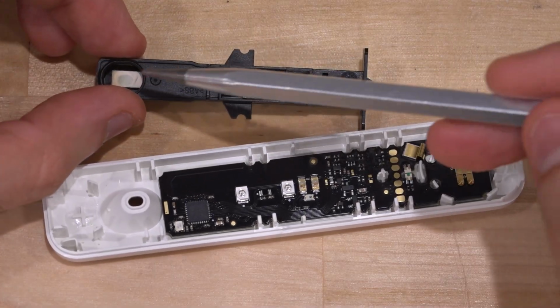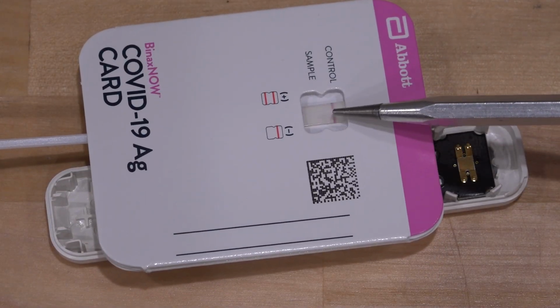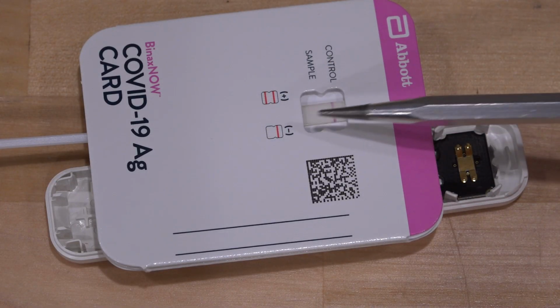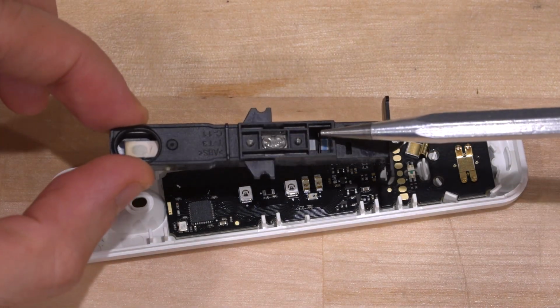So I think what happens is when you drop in the sample, as with any other ones, the original one that I showed you, for example, this one, if you don't see the control line, the test has been done incorrectly. So this is a good way to ensure that the dye is there and then the fluid has been wicked in there and then everything is working kind of correctly. You can see the difference between them. So I'm assuming that exactly the same thing is happening here. And I'm sure we can open this a little bit further.